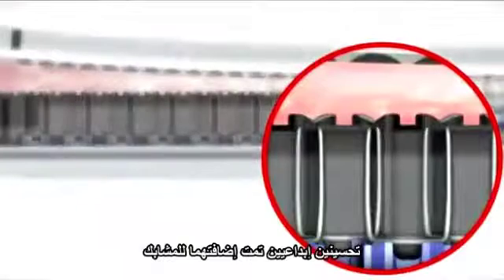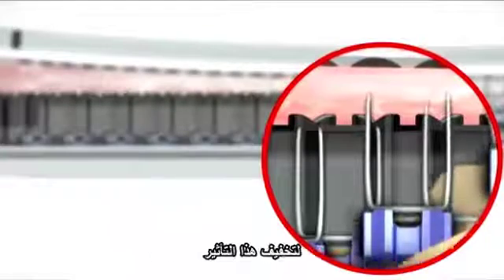Tissue slippage during firing can push staples off course, causing one or both legs to miss the anvil pockets, leading to malformed staples. Two innovative staple design enhancements have been implemented to moderate this effect.